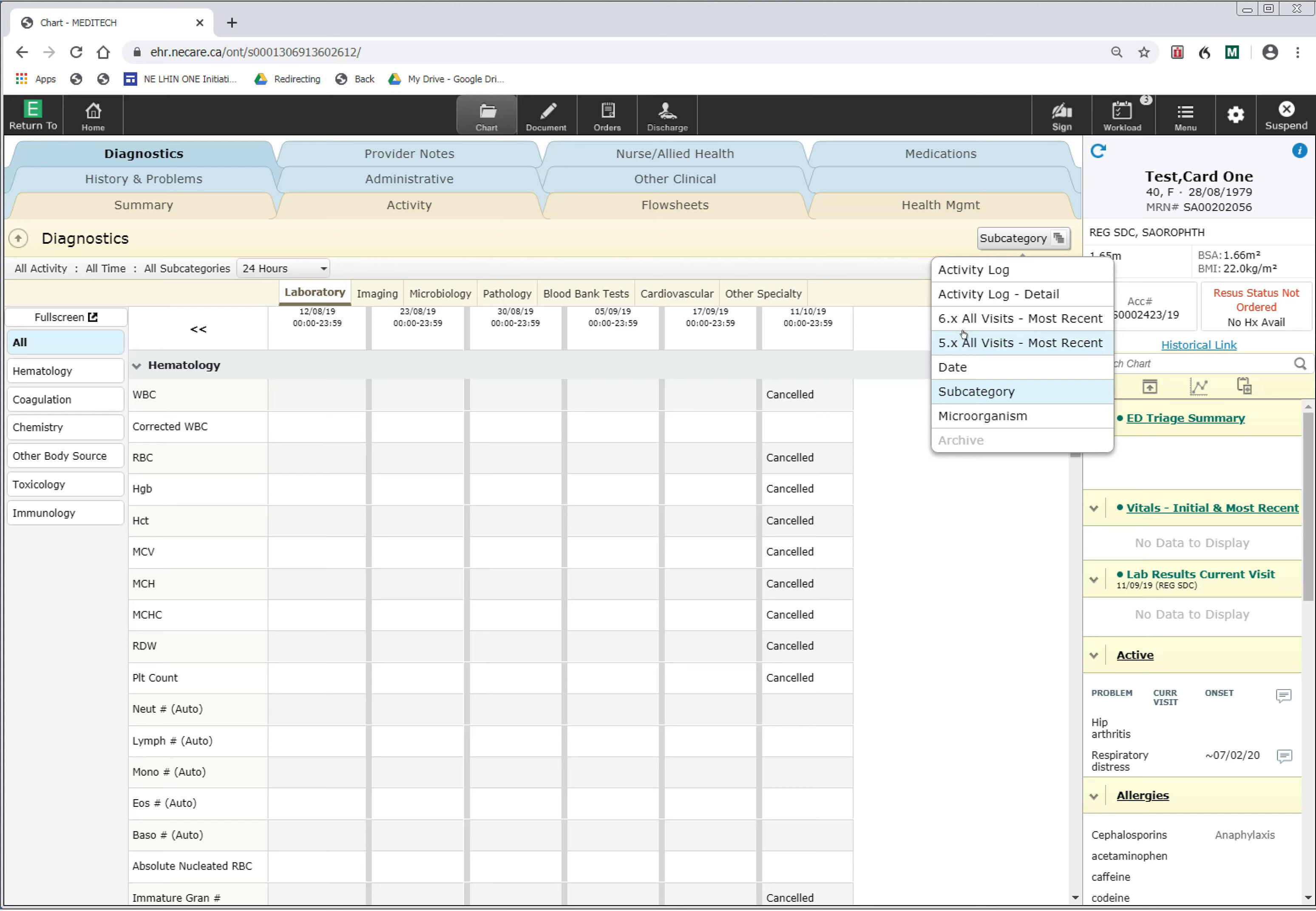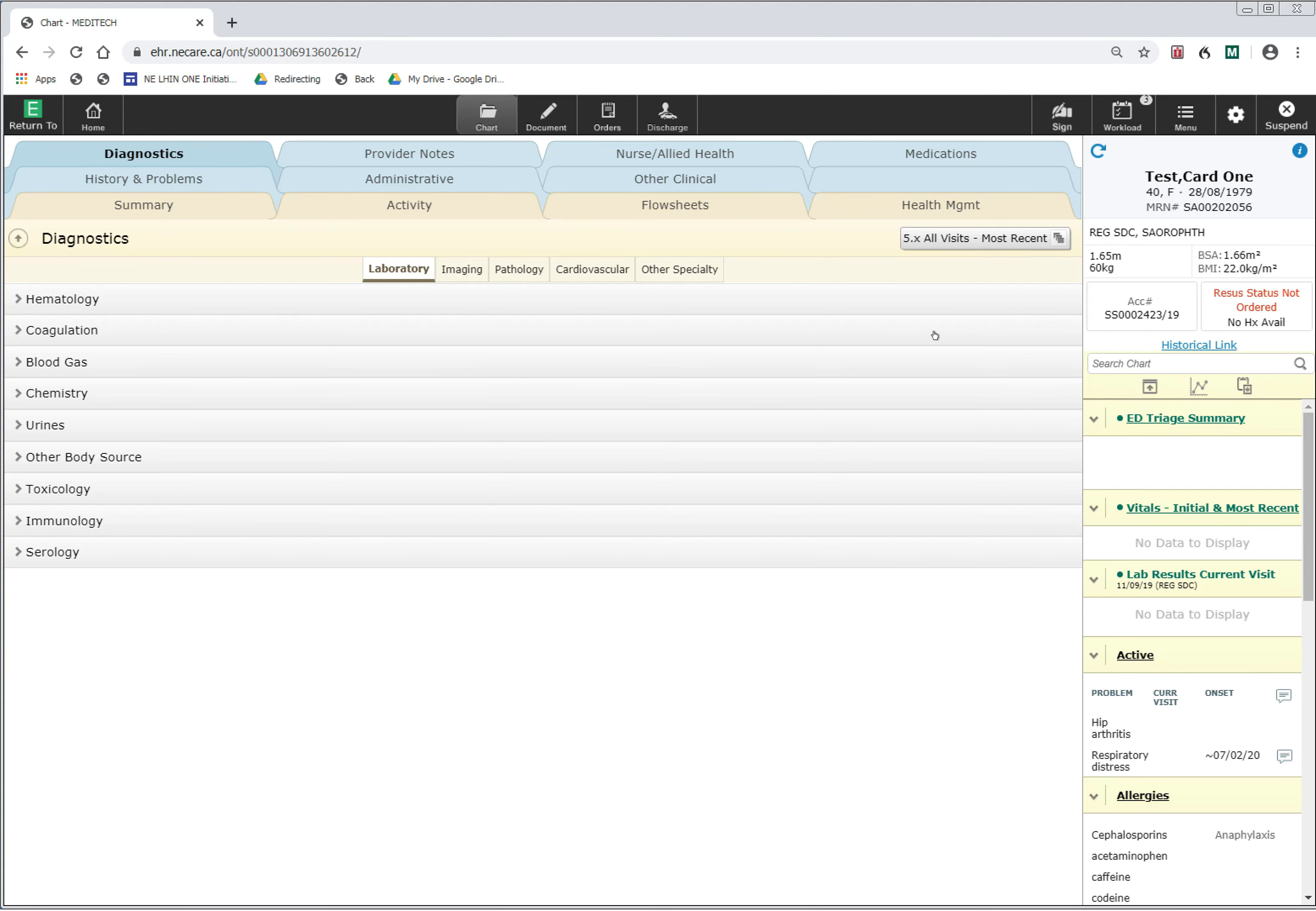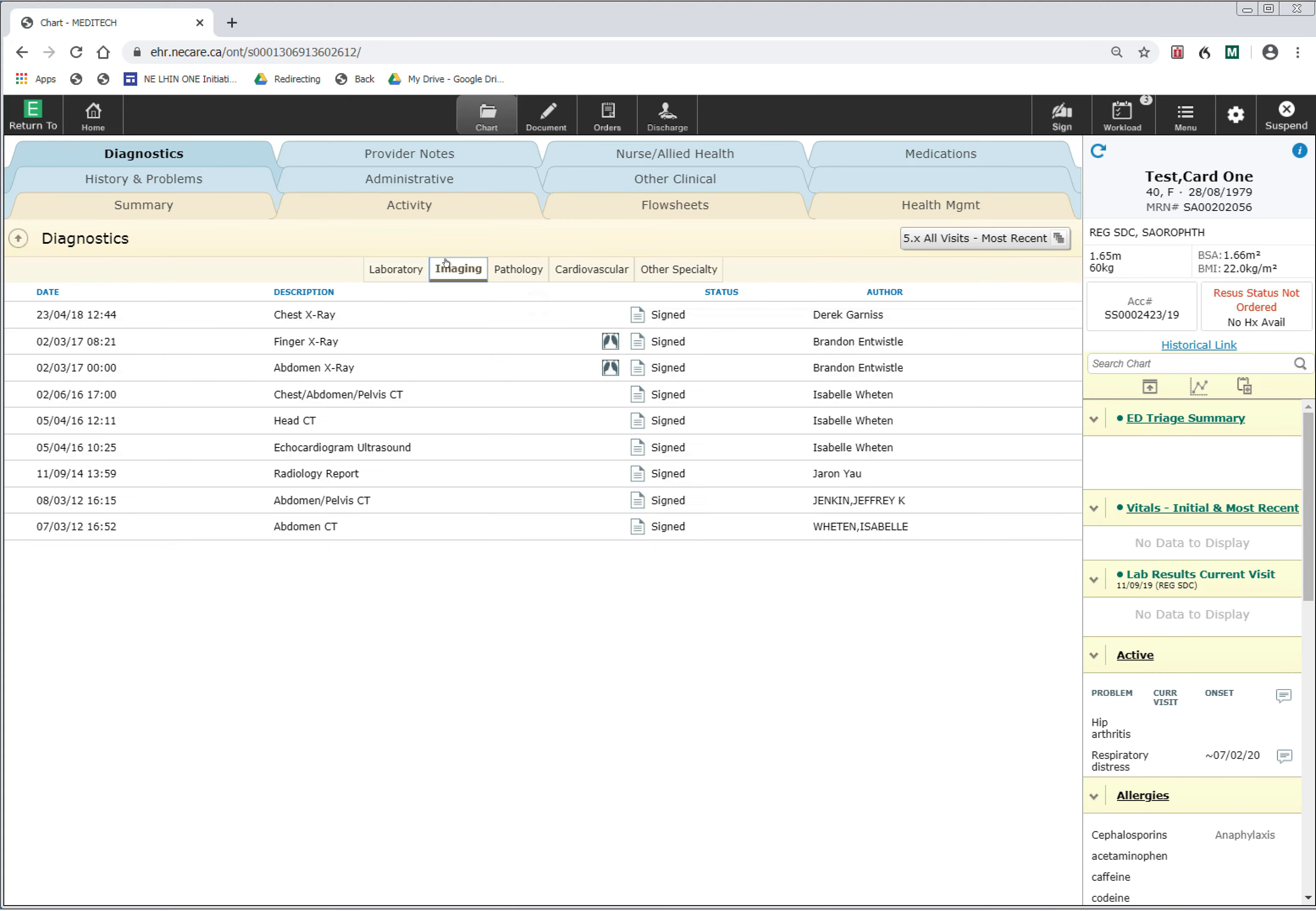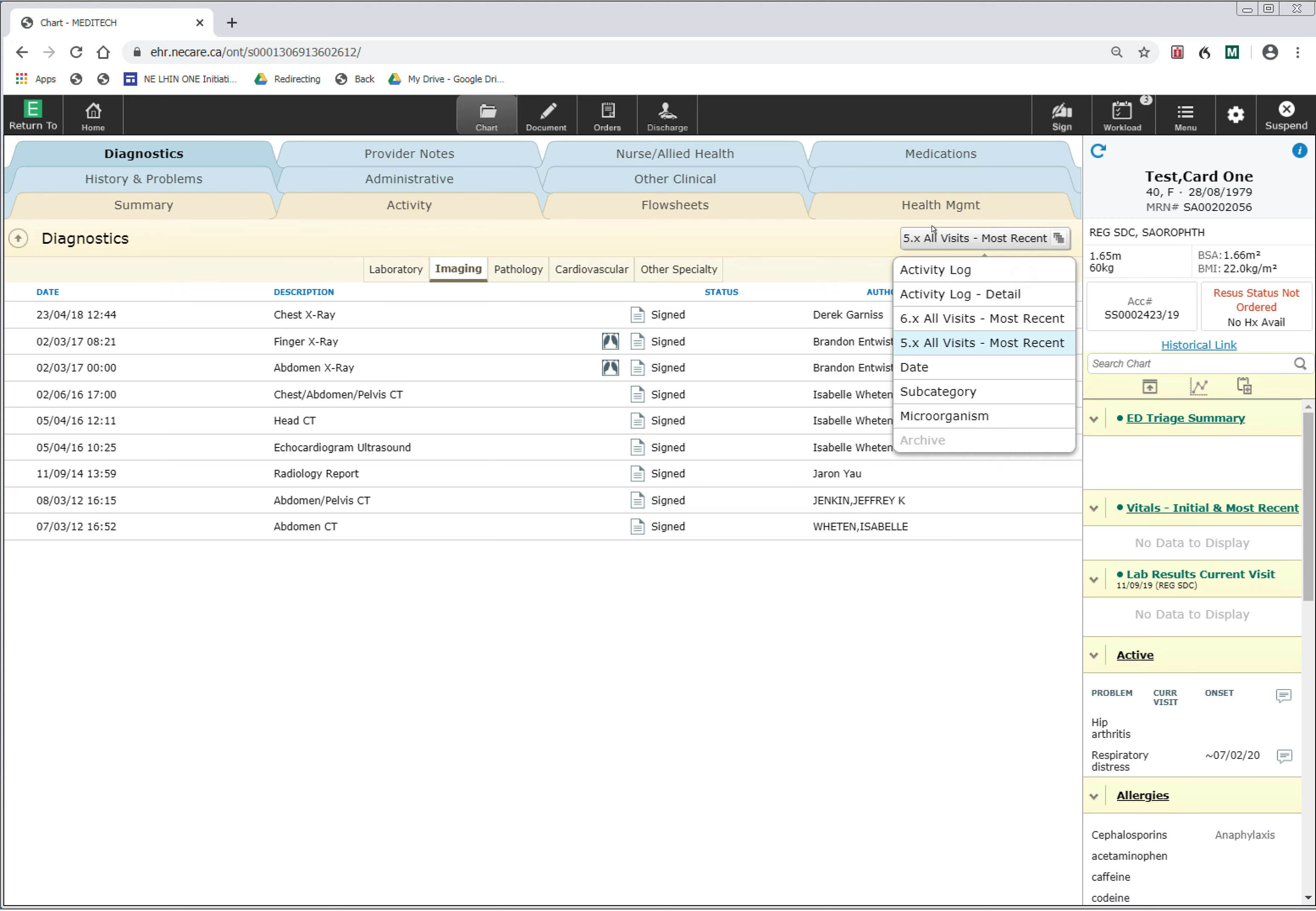I'm going to click on the 5.x All Visits, and this is going to allow me to have access to the diagnostics within the old Meditech system. If I want to look at imaging, I click on the Imaging button, and it will present me with imaging that was done on this patient from the old system. I can once again toggle back to the new Meditech system data by clicking on the 6.x All Visits.